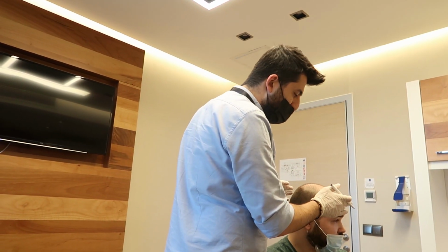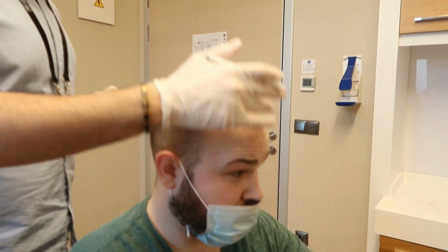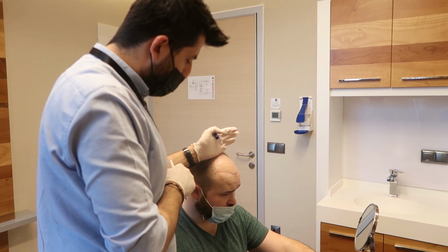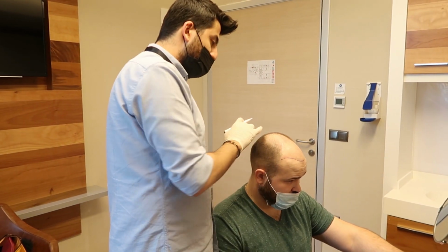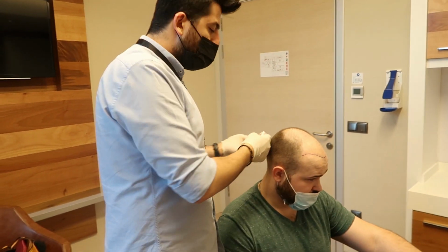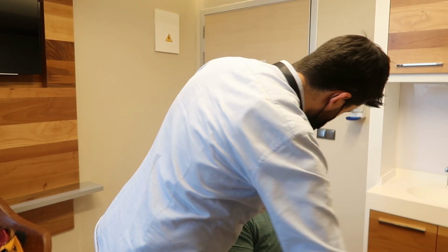Actually a little bit lower than that, but we need to start a little bit higher because the empty area is really big, and the number of grafts that we can extract from your donor area is not enough to cover all. So we need to make the area smaller. Basically, we will start from that part, and we will implant until that area. Almost like the first 50% of your emptiness. And 1 year later, after your donor area heals well, we can make another operation for the rest of your hair, because as I said, the number of grafts that you need for full coverage is huge, and we cannot harvest that number at one time. So we need to do that in 2 steps. Okay. Let me check your beard too. I actually expected that.